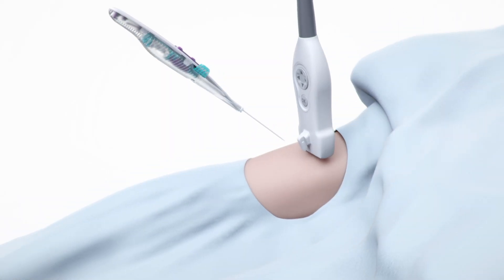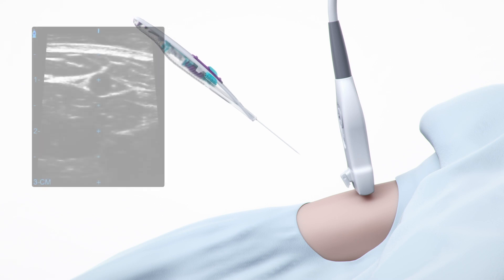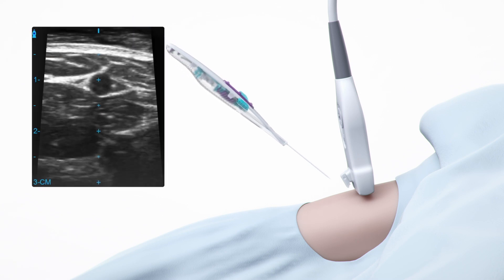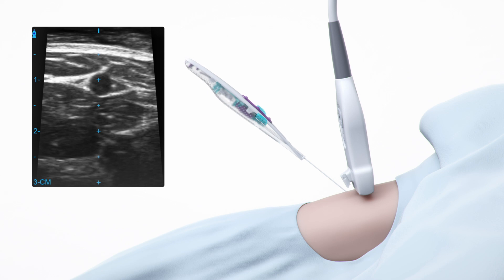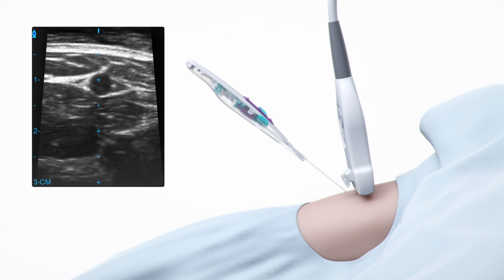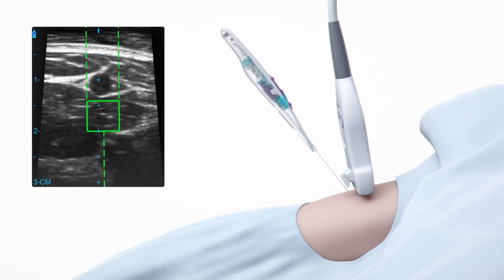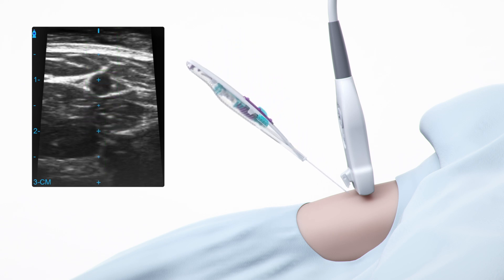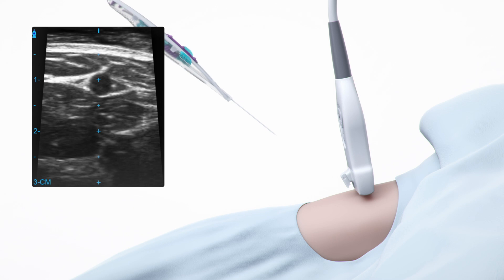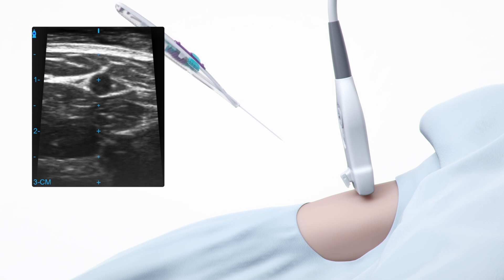Once ready for insertion, begin by introducing the needle to the probe at a typical insertion angle, about 45 degrees, until needle tracking appears on screen. If tracking does not initialize, temporarily increase the needle angle to pair with the probe and initialize tracking. If it still doesn't begin tracking, separate the needle from the probe. Confirm that the performance indicator increased and then reintroduce the needle slowly.